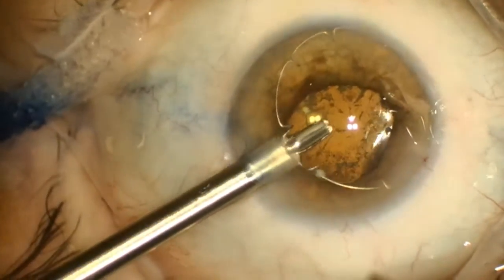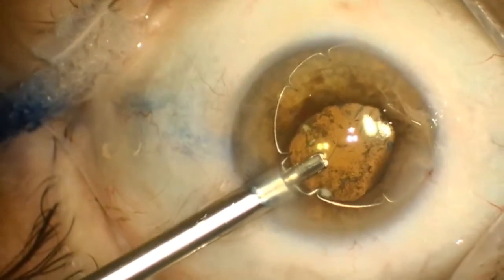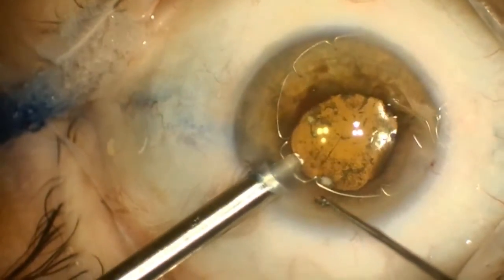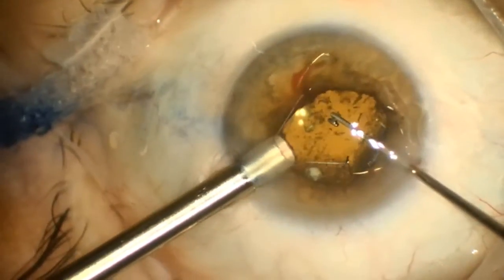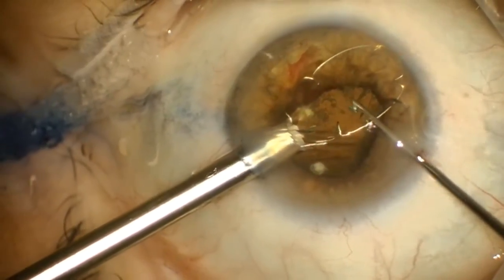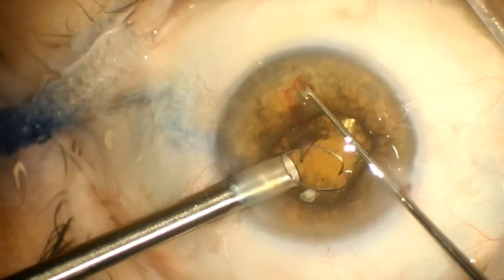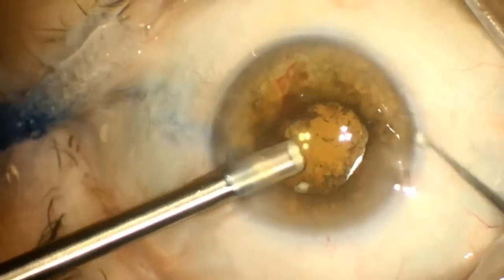For proper folding, it's important not to grasp the ring too far down the injector or at the tip, but in the center of the injector device. Once it's in the proper position, the plunger is retracted and the ring collapses into the injector. The second instrument is used to ensure that the ring stays in a planar configuration and does not move anteriorly or posteriorly as it retracts, avoiding any iris or corneal trauma.